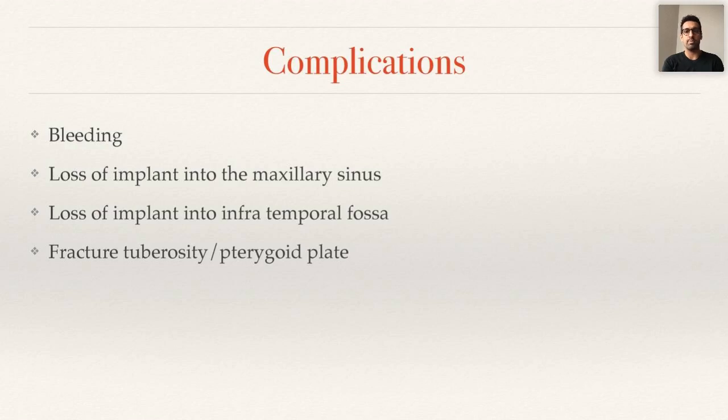It took me maybe 12 to 18 placements before I started to really build up my confidence in placing pterygoid implants. So yeah, simple surgery, but complex territory. It's certainly a technique, and it's very much a blind technique, and a lot of it is feel. Okay. Any questions about the complications? Because I think we're going to go on to some clinical cases next.